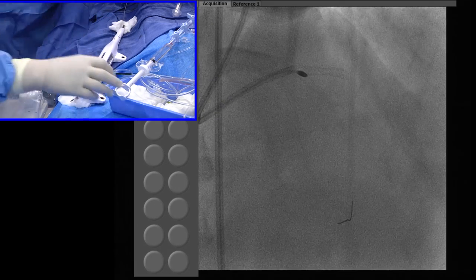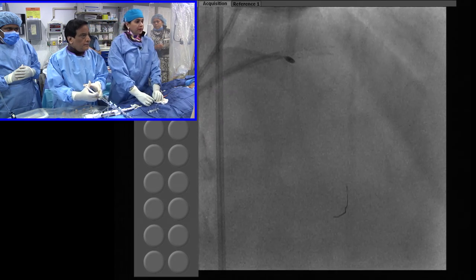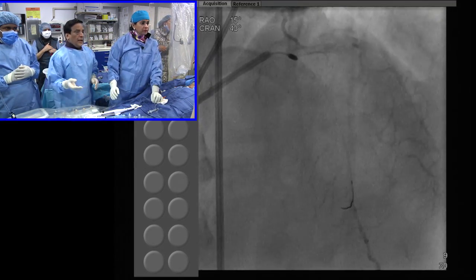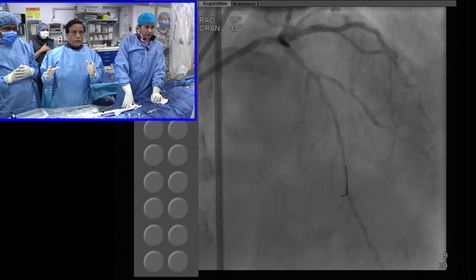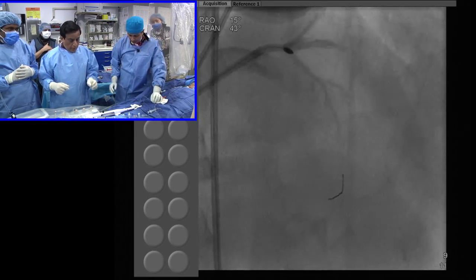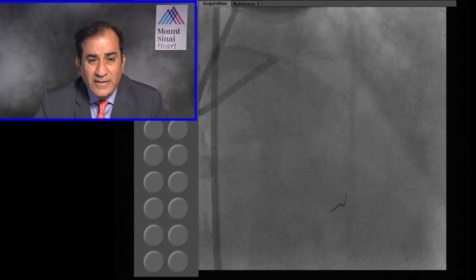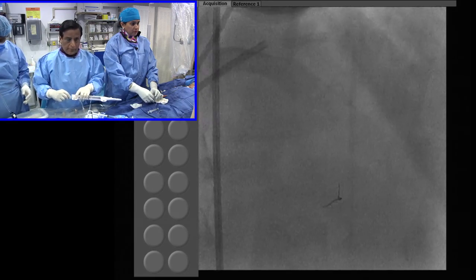Take it out. Hold it. Now, good. Go to cine. Go to quick cine. Cine. Yeah, I think you could go with this, because this is my test. If your burr is in the proximal vessel, you give a dye. If there is total occlusion, that means the burr is too big. Already wonderful. Okay. You want to come out? Okay. We get a 1.5. That's a very, very nice, very elegant way. I've never seen somebody describe it so perfectly. That would be a nice way for you to check if it is too big.